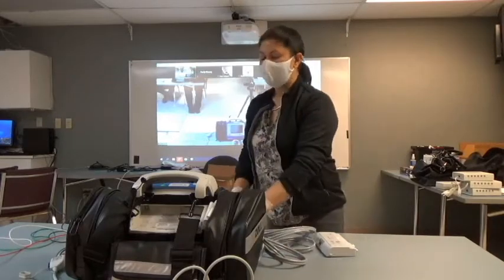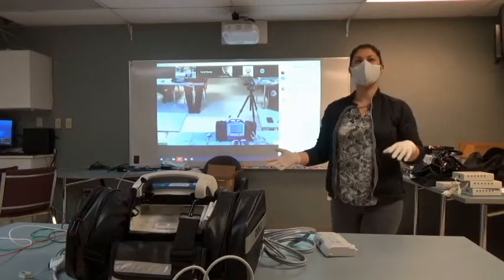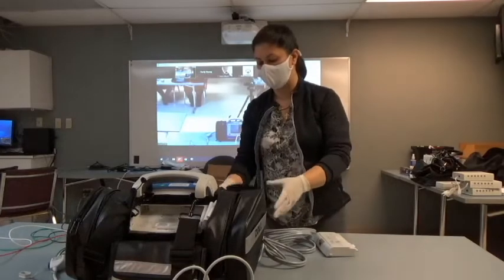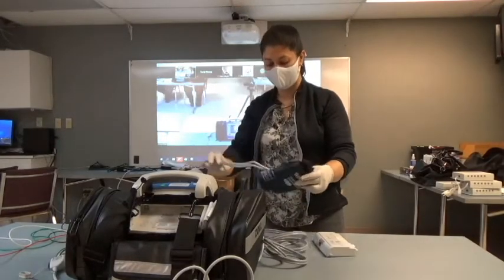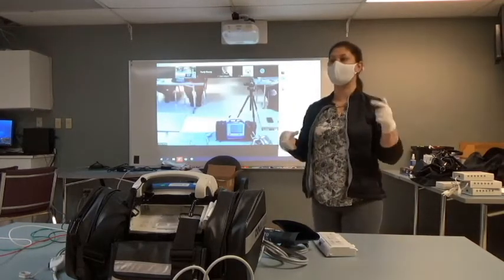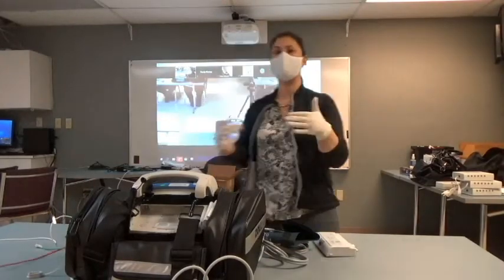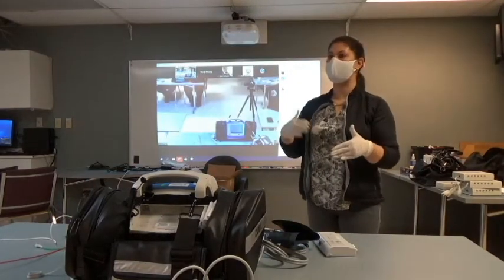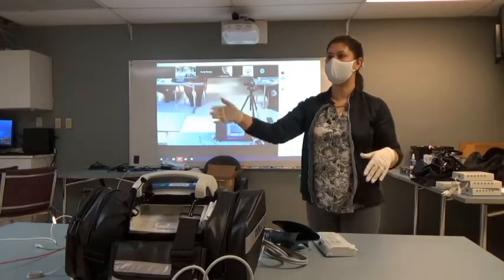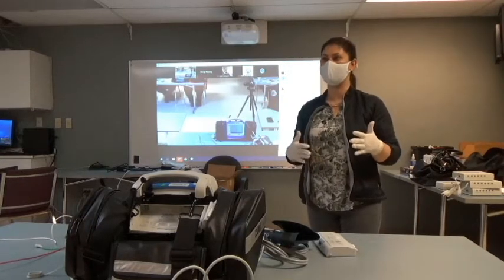So it is important that we're sizing these cuffs up the right way, so that way you guys are not struggling to get these blood pressure readings and the machine isn't struggling to get them. So again, those are your sizes. The other thing that this does that's a little different or unique, so if the machine is struggling to get a blood pressure reading and you place the patient onto the four lead, they're gonna talk to each other. It does that by syncing to the patient's R wave, and it'll go, okay, I should hear a beat here, here, here. Let's ignore the noise in the background to help you get a blood pressure reading when it's struggling.